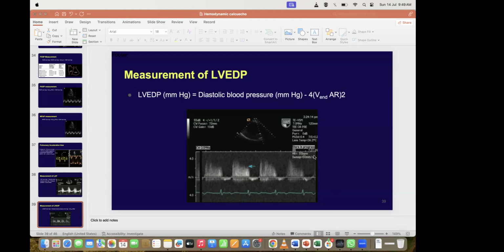What I'm telling is in the context of sepsis, it might affect the patients who have less MAPSE, they have a higher mortality compared to your EF percent. That's what they're thinking at this point of time. Maybe in the future it might have a role. Some studies, in the future we might see more studies on this aspect.